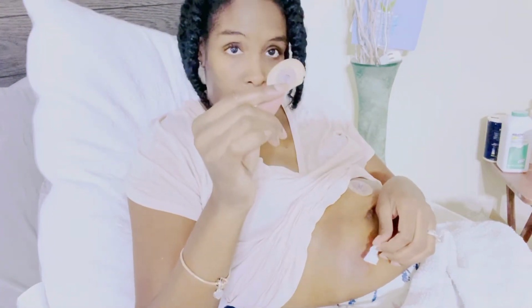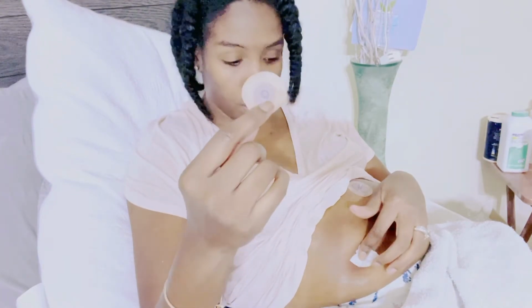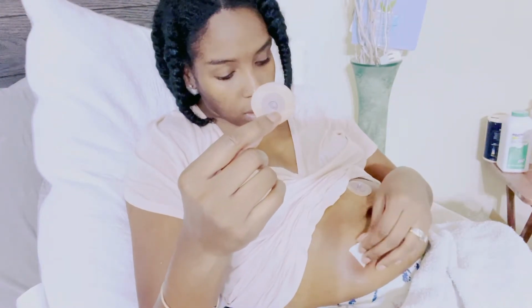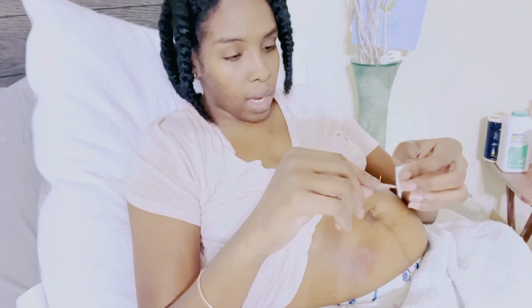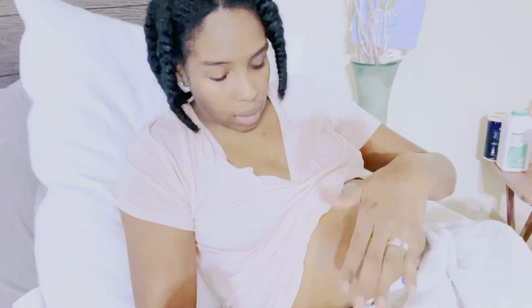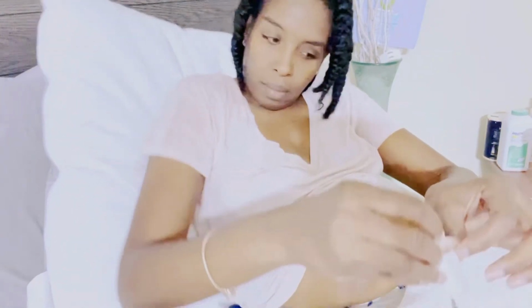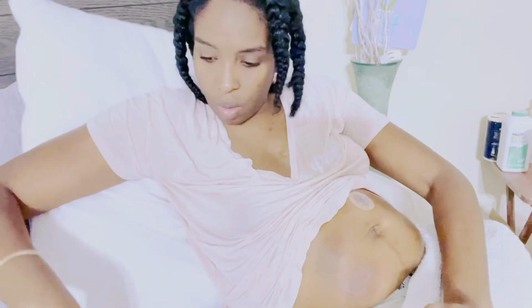So this piece I would consider something you should put into your biohazard container as well. Your needle stick container. So now that that's all sorted, oops, see, my machine is like, you're taking too long.